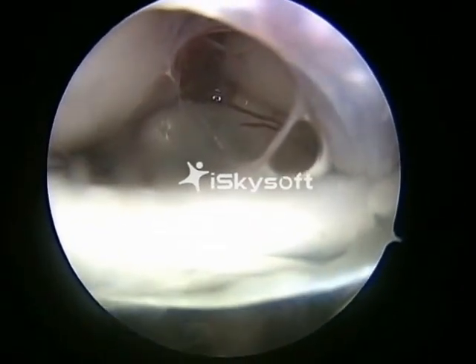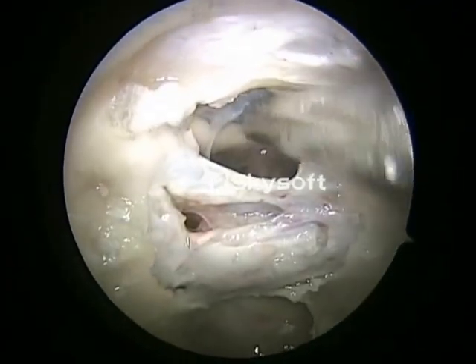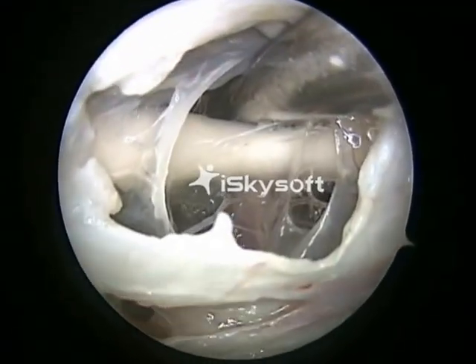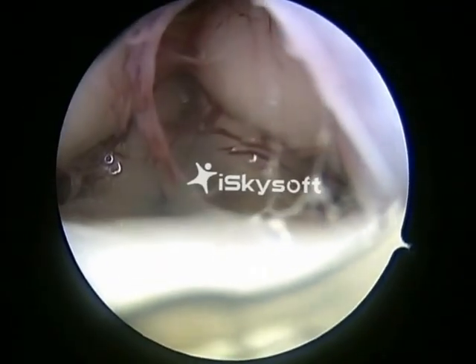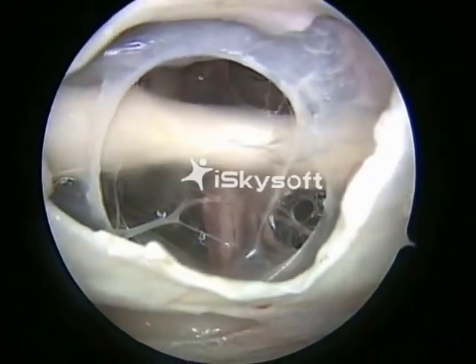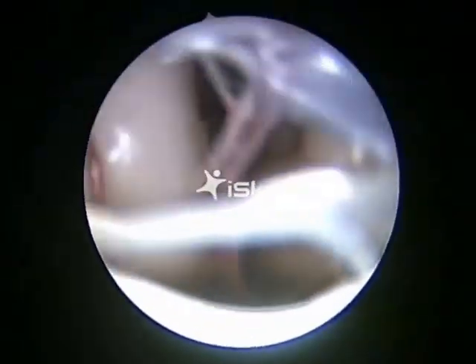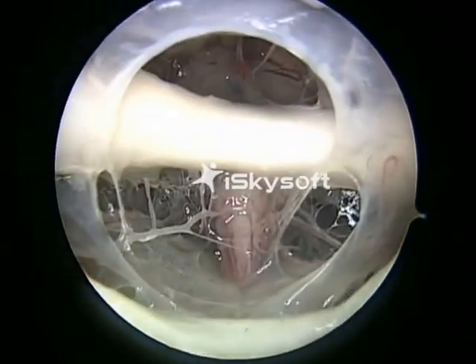Now we are seeing the suprachiasmatic region. This approach is a very useful approach for tumors going above the optic chiasm. That's the suction tip being used just above the optic chiasm. The pituitary stalk very clearly seen. We're using a 30-degree telescope now. The skull base, the suprachiasmatic region. You can now have a look at the pituitary stalk, the optic chiasm.